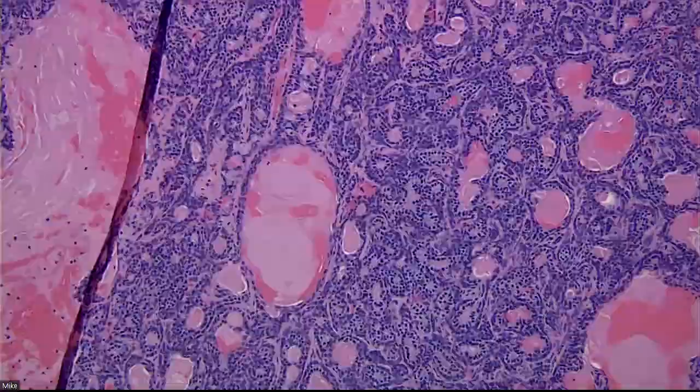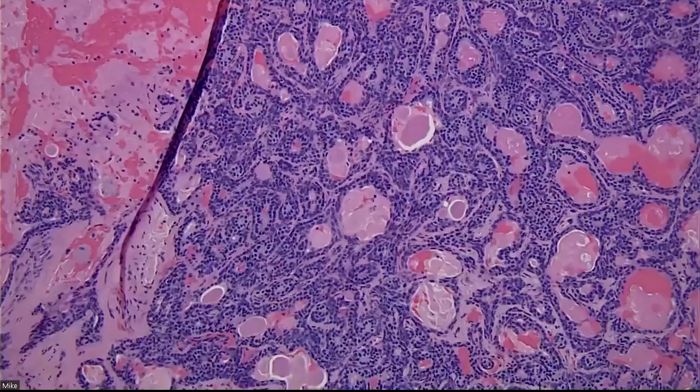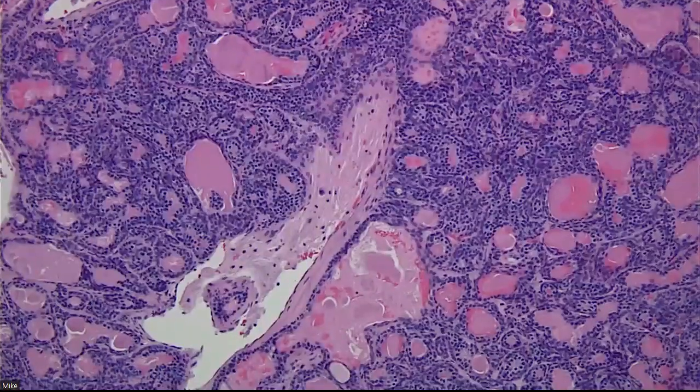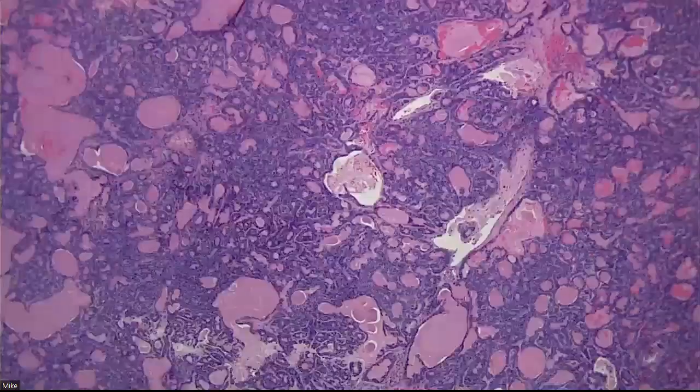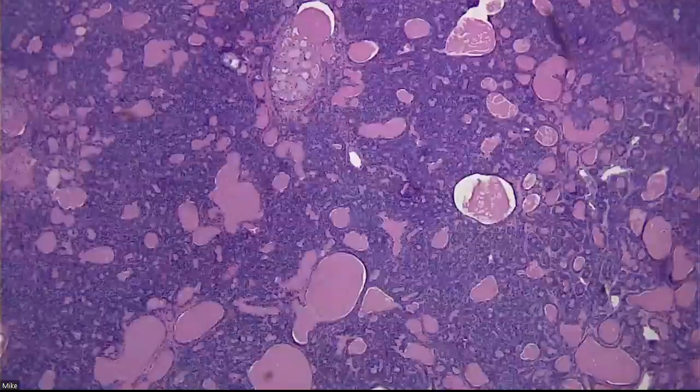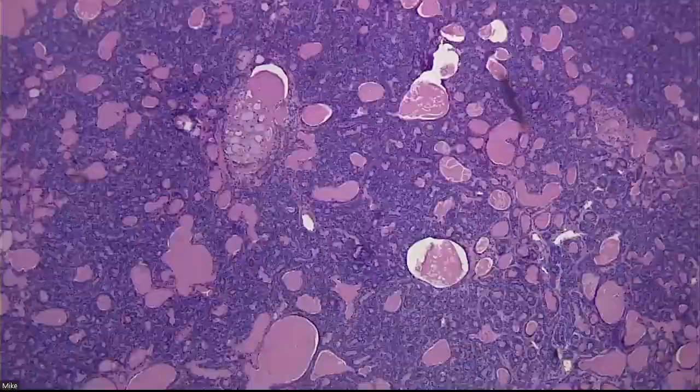So the other thing you said was what? Basal cell adenoma. Tell us about basal cell adenoma. It's actually a biphasic tumor, just like PA, and it can look like this. So what do you want to see?